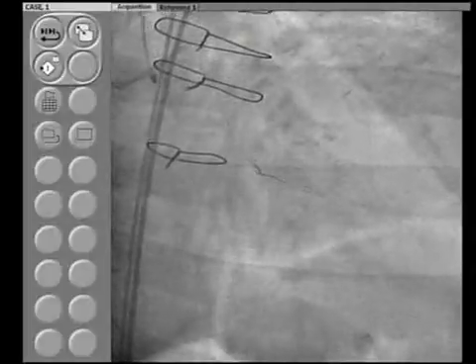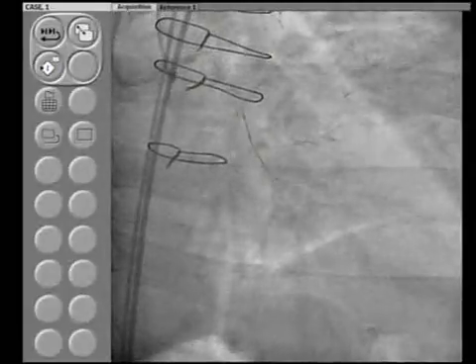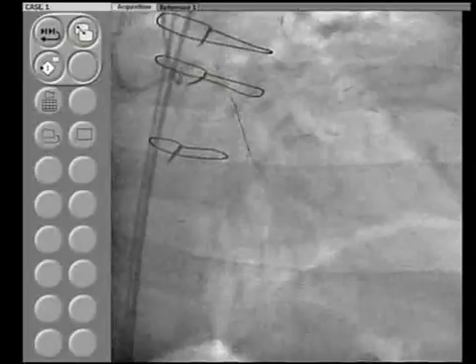We are subintimal. Yeah, it looks like we are a little subintimal, so why don't you pull back your catheter a little and then try to rotate, give a torque. Once you have gone subintimal, the issue remains whether you need to use a parallel wire technique or pull back and try again, knowing that earlier we were there. It's almost like the second of those subtotal occlusions. The second lesion, because the wire was handling very nicely before. Because there was another subtotal lesion at the level of bifurcation. So now here actually we may use a Whisper.